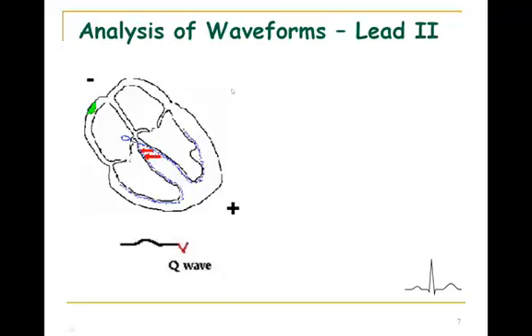If I run different views of your heart, do another standard limb lead, I probably would pick up that Q wave. But it so happened with running a standard limb lead 2, depending on your heart, how it's situated in your chest wall, that vector may be running perpendicular to the lead axis. So the Q wave is not very big because there's not a lot of muscle mass, plus the vector is running relatively perpendicular to the lead axis.